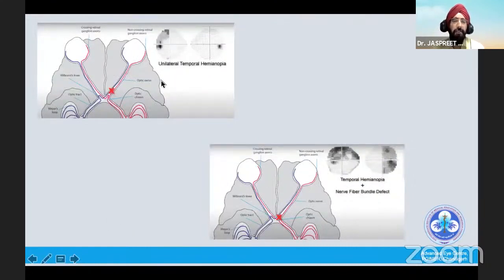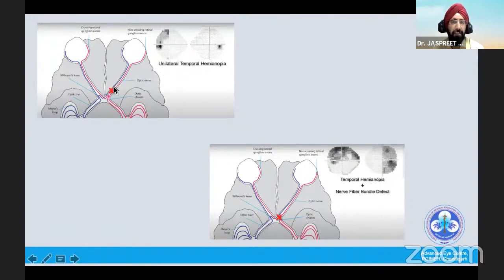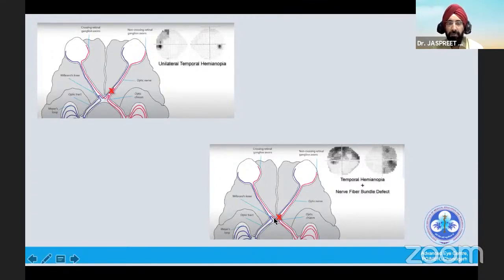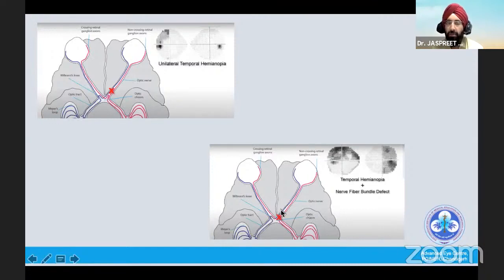Some rare causes include unilateral temporal hemianopia — it is a rare thing to have, affecting just the nasal fibers of the posterior optic nerve. More common is when you have the junction involved: you could have a temporal hemianopia in one eye and a superior temporal scotoma in the other eye, or a central cecal scotoma in one eye and a superior temporal defect in the other eye — which is known as a junction scotoma.